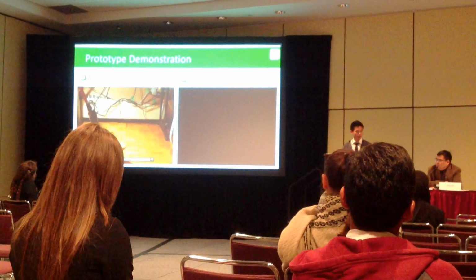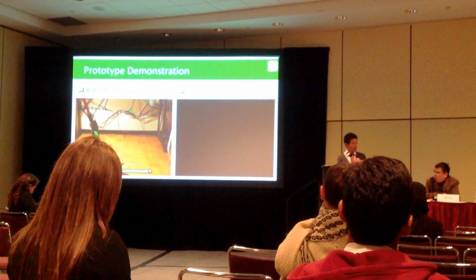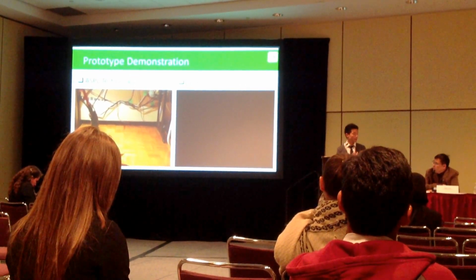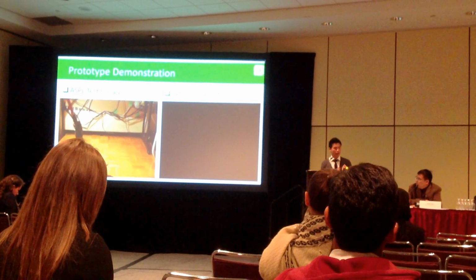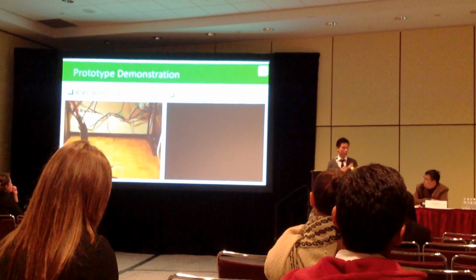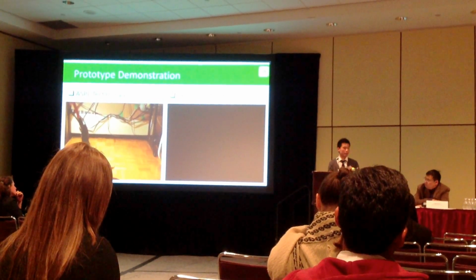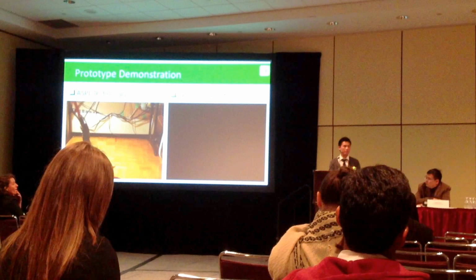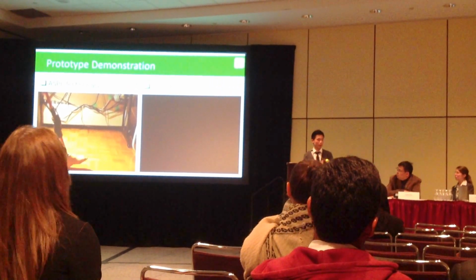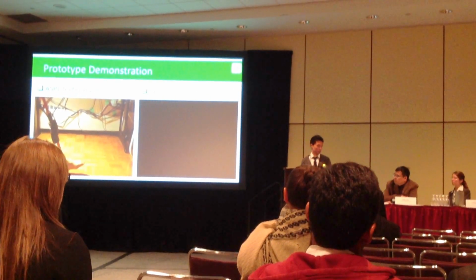It's provided because there's a lock spring at the back, which is constantly applying pressure on the lock. So the stiffness of that polymer will be the resistance. We bought in multiple different polymers, and we're going to test them out when we put a child on the test, and we will see which one actually suits them. Because different users have different weight and different gait. So we want to make sure that we pick one that will suit them, but we already have different ones for exchange.